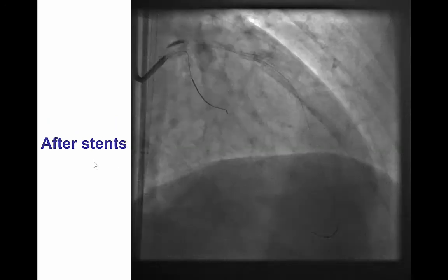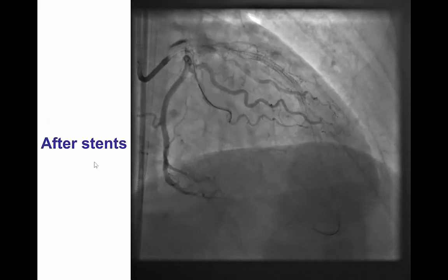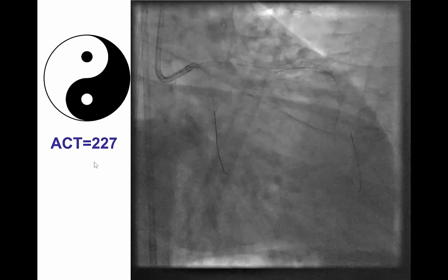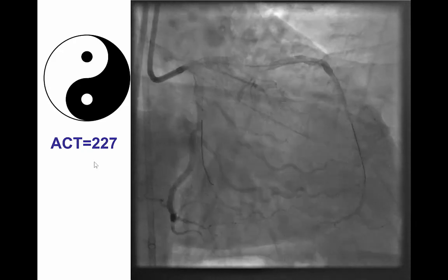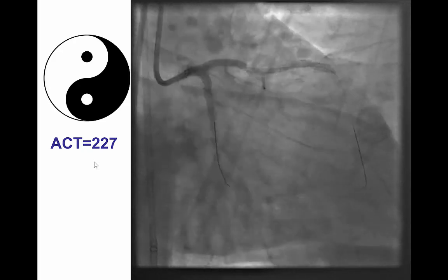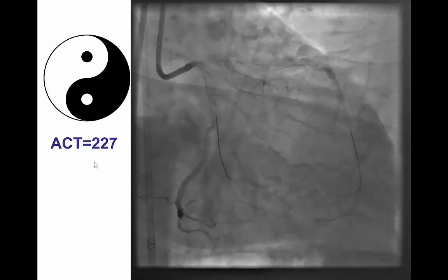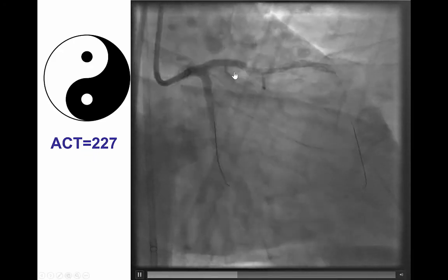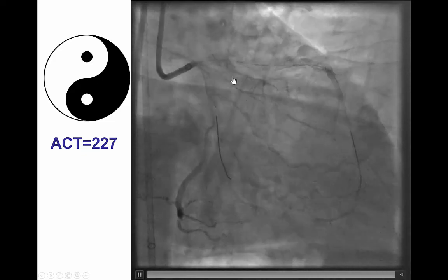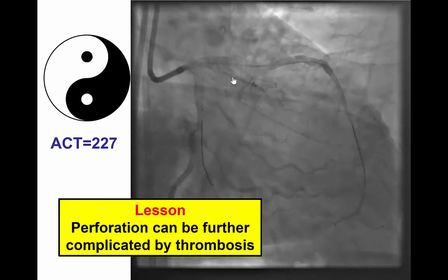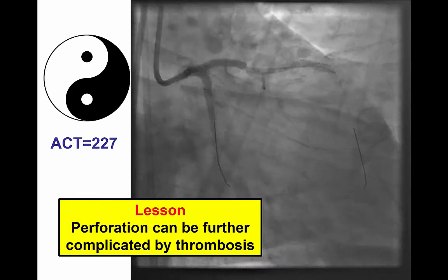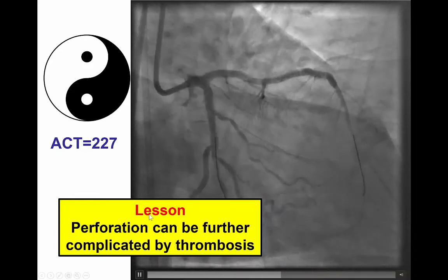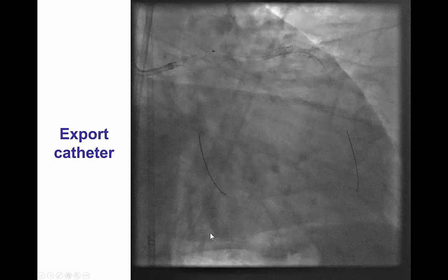The proximal stent was deployed and we now have good flow in the LAD, but we still have some staining. Soon thereafter, the ACT was a little lower. We didn't give any additional heparin, but we did not reverse the heparin effect either. Then we observed that there was a filling defect forming inside the stent — that was thrombus within the recently placed stent. It's one of those unfortunate events where one complication can bring another: we had perforation that is now resolved, but now we have thrombosis in the same patient.